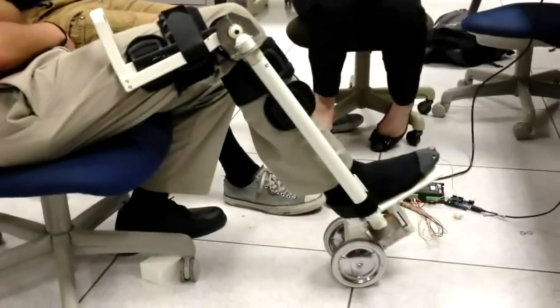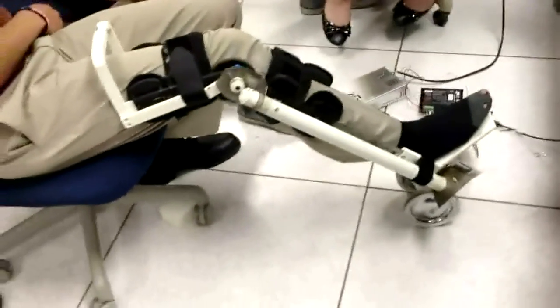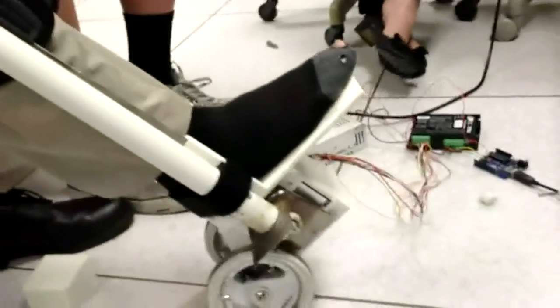The drive shaft currently is not connected and the motor is not powering the device due to kinks in the drivetrain. Our device is not entirely complete yet and still requires a few touch-ups until it is ready to function, as you can see.